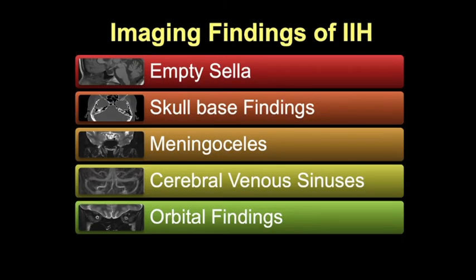So there are some characteristic imaging features of IIH that we can see and identify in our cisternogram and imaging workup of CSF leak patients. And it's important to recognize and report these, as these patients are historically more challenging to deal with, as they may recur more readily or spring another site of leak after one site is repaired. Identifying the possibility of underlying IIH may alter the management of these patients, as the surgeons may be more aggressive about treating them with Diamox or lumbar drain perioperatively.